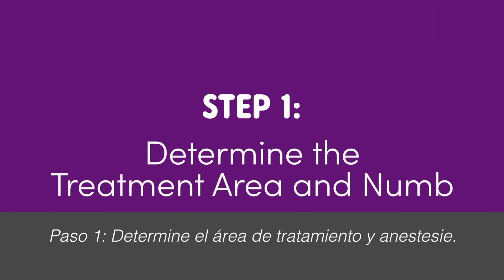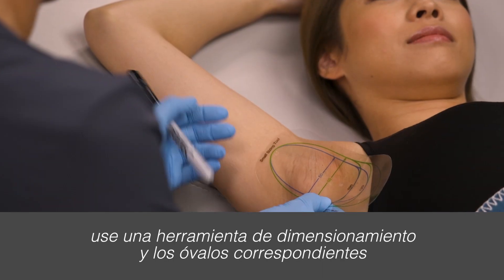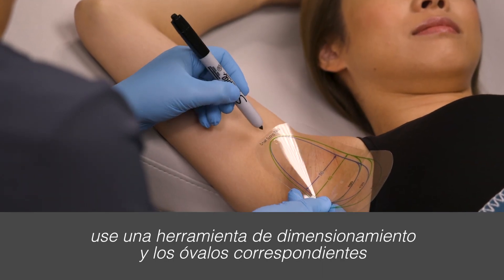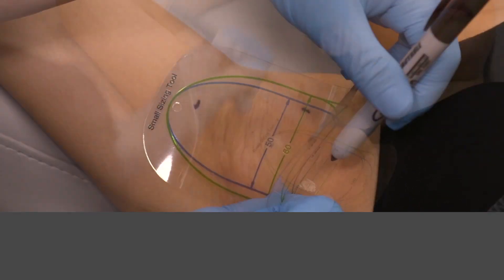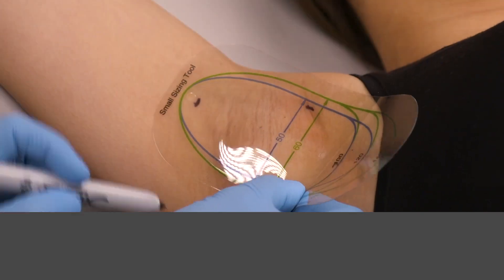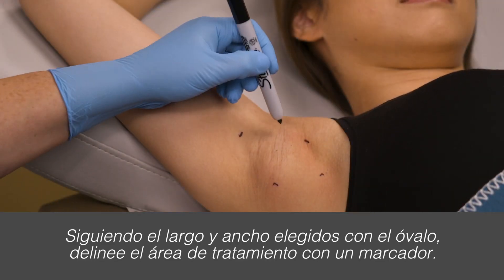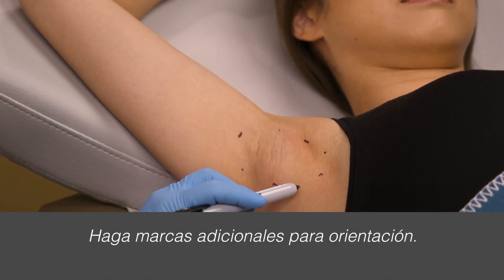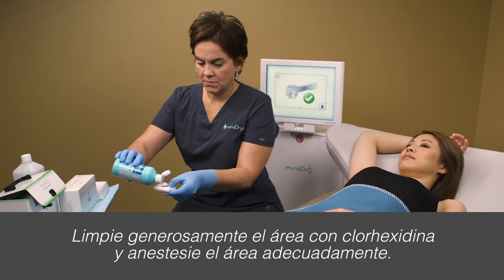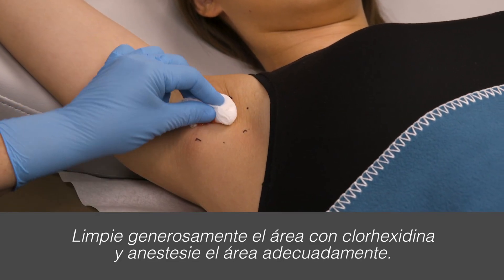Step 1: Determine the treatment area and numb. Based on the hair-bearing areas, use a sizing tool and corresponding ovals to determine the approximate width and length of the treatment area. Following the width and length of the chosen oval, outline the treatment area with a marker and make additional marks for guidance. Generously clean the area using chlorhexidine and appropriately numb the area.